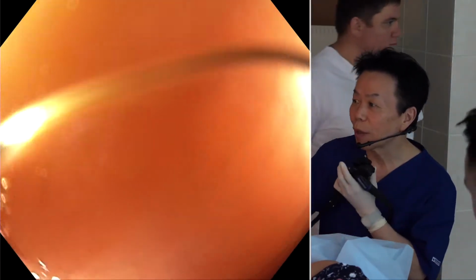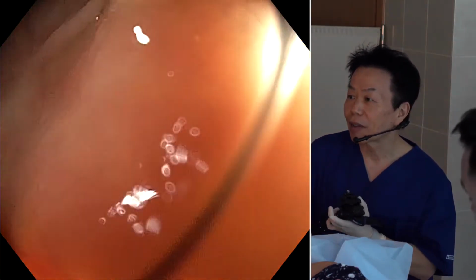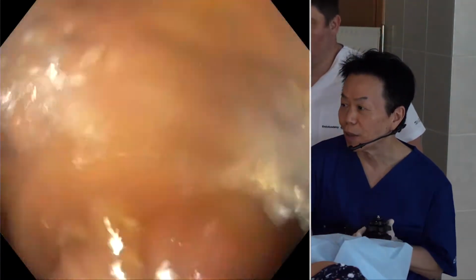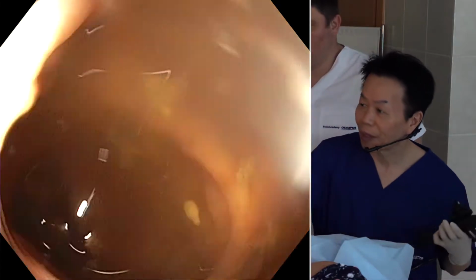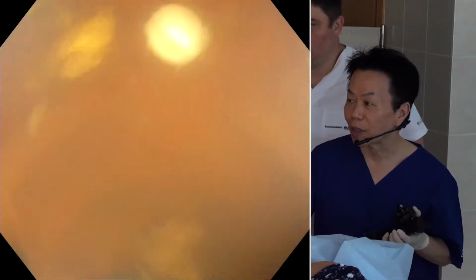So if I feel it is difficult to go beyond the sigmoid-descending junction, I often change the position to supine or even right decubitus position as necessary. But today I'm trying not to change the position of the patient during intubation. If the patient is sedated too much, it will be difficult to change the position.